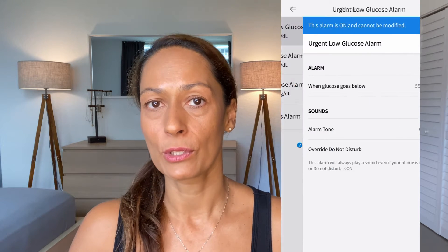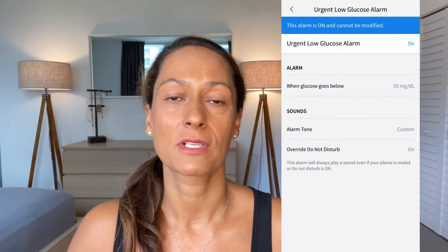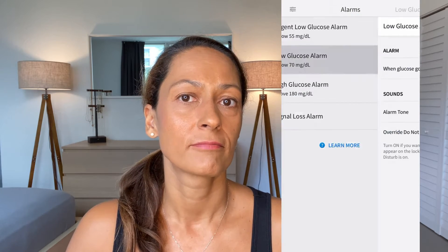There's also an urgent low alarm that will sound when blood sugars hit 55 milligrams per deciliter — that one cannot be turned off. In my opinion, this is all fine; this is what a CGM is supposed to do. Before we get to accuracy, I want to talk a little bit about reliability, because unfortunately this Libre 3 sensor had some reliability issues, and that's just not a good feeling when it comes to a CGM.